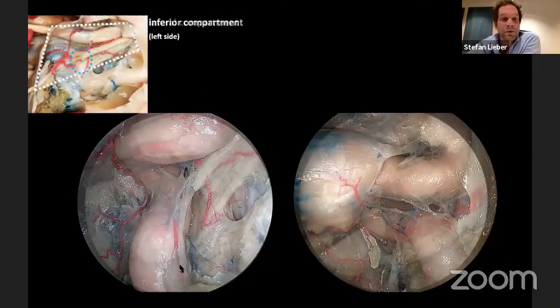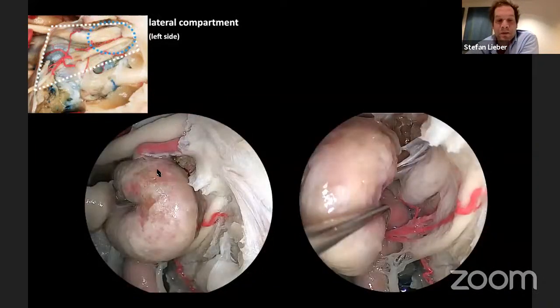And finally, the lateral compartment, which is hidden behind the anterior genu. In order to visualize this, the anterior clinoid and the clinoidal and dural rings need to be cut, and then the genu needs to be medialized, which exposes the inferolateral trunk, 3 ascending nerves towards the superior orbital fissure, which is essentially between the optic strut and maxillary strut.